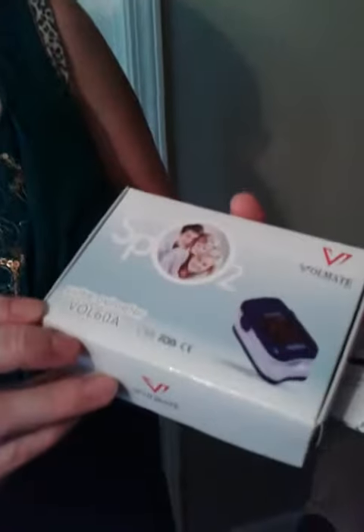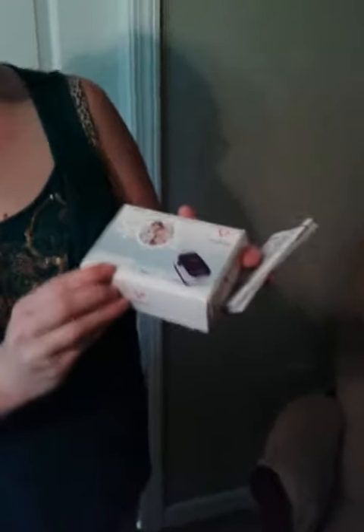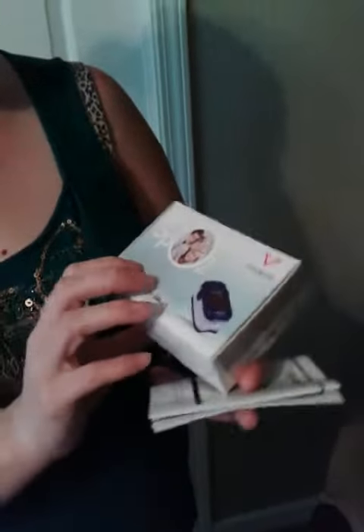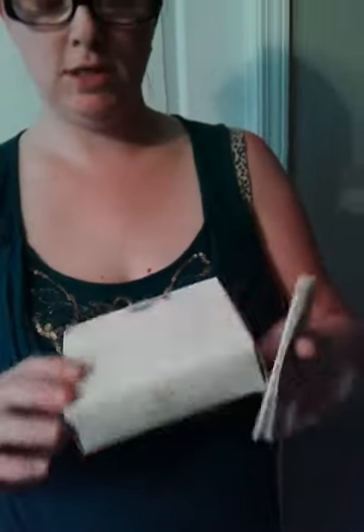Today we are doing a review for Thomason for the Pulse Oximeter VOL60A. It is Volmate and it gives you some information on the back of the box.